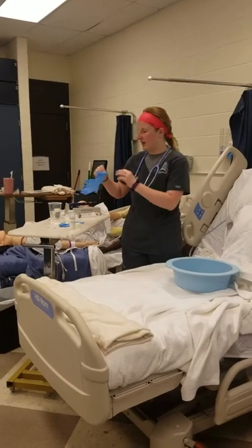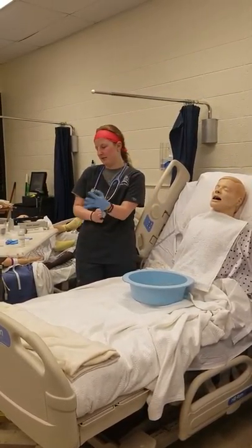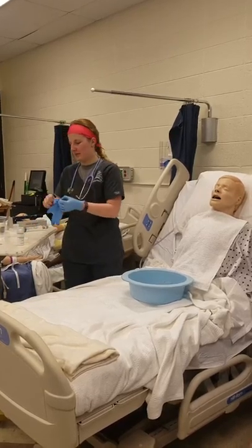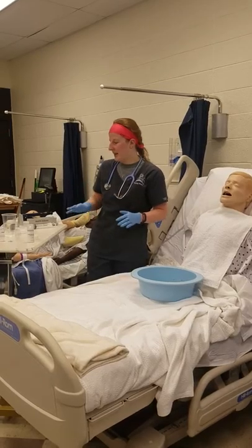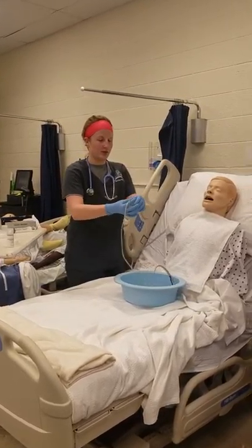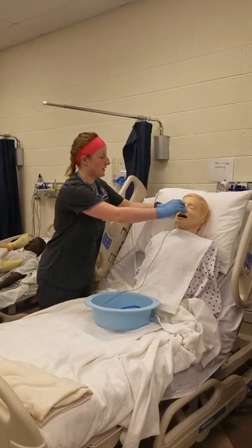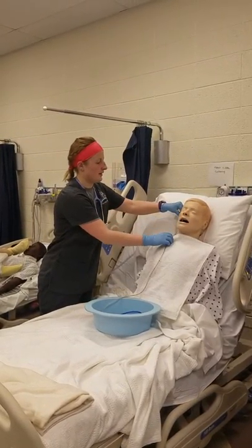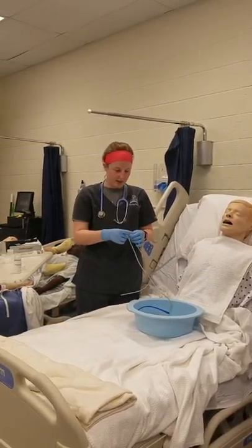I'm going to don on a pair of clean gloves. I'm going to make sure I already had my tape and everything ready to go. I'm going to measure the tube by going from nose to ear, and then from ear to xiphoid process, and then I will mark that with a piece of tape.